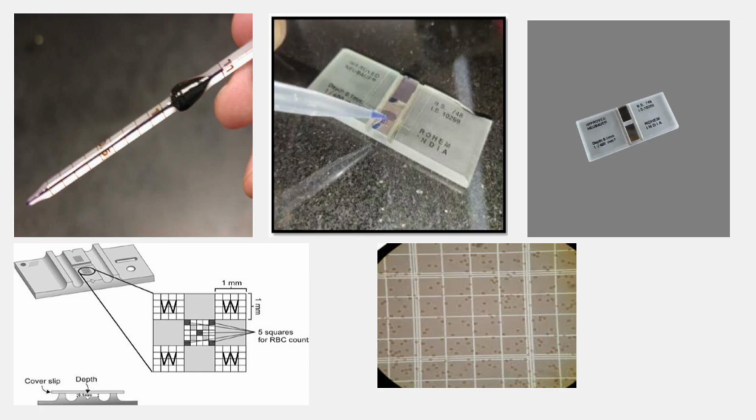So we can see the Turk's fluid in the WBC pipette, and the second picture shows how it looks when we are charging. After charging, it will look like this, and then we will focus on the 4 corner chambers: upper right, upper left, lower right, lower left. Under the microscope we can see these 4 chambers containing the WBCs, and we have to count accordingly.